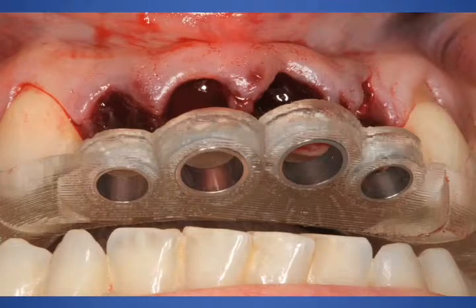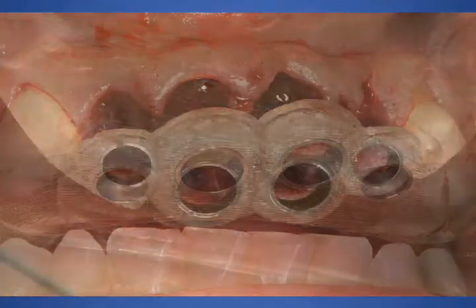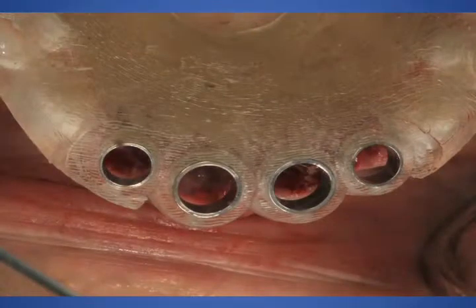They've already created models and positioned the final teeth where they ideally need to be. This surgical guide fits on the occlusal of the teeth and needs to be stable. It cannot rock in the position, so it's really snug and kind of snaps into position. An occlusal view of the same.